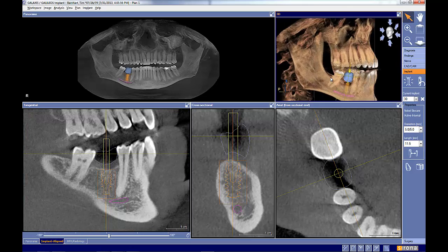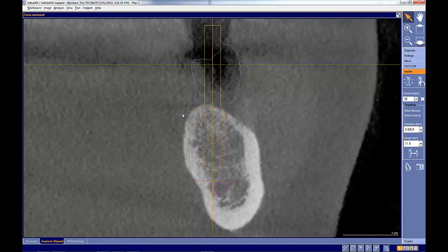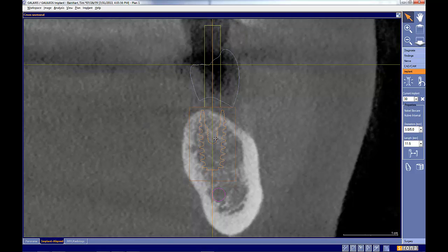So in this particular case, it was properly done. Next, we look at bone level, and if we take a closer look at this, we can see that we're subcrestal. In an ideal world, the implant is right there, but there are two things that worry me about this particular implant position. One is we're a little bit out of the bone right here on the buccal, thinner tissue with resorption. Very likely that that implant grayness will show or will require grafting.